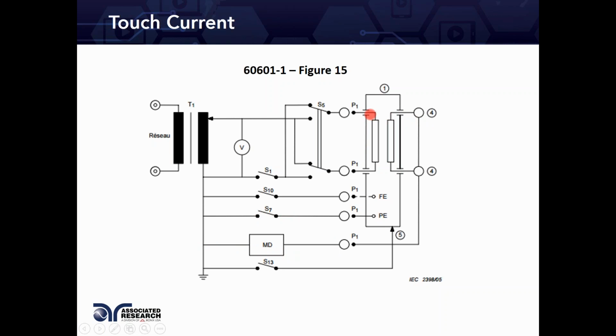All the leakage that's going to happen is due to the nature of how isolated the input is to the output of the applied part. The biggest isolation you get for a medical device, if you're using an AC to DC converter, comes from the power supply.